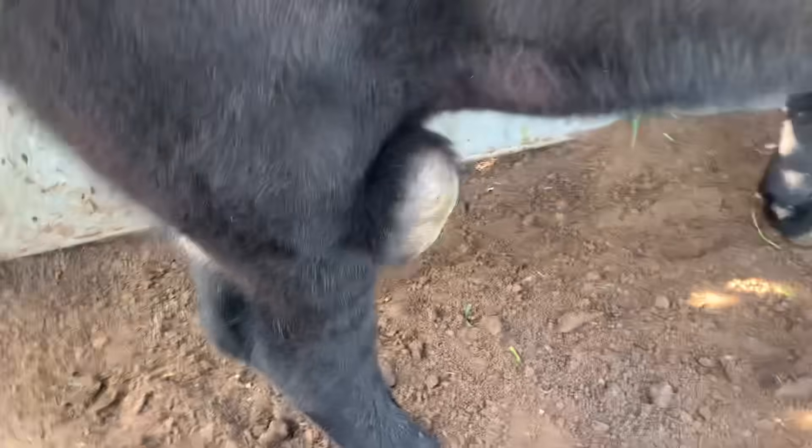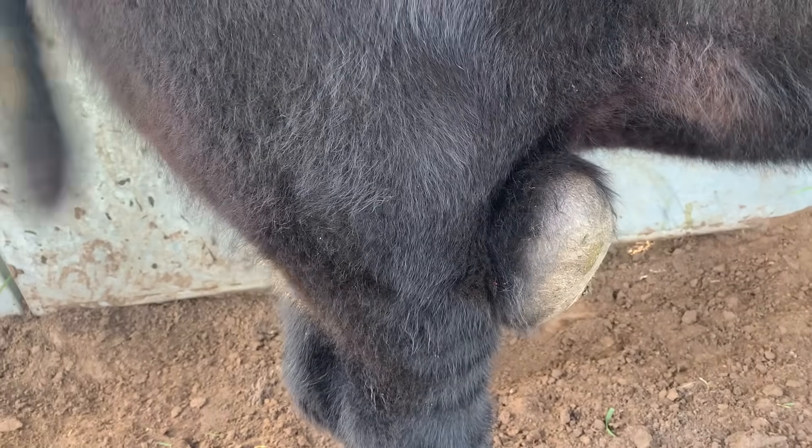Massive. There's a mass for you. We're going to try to remove this mass. If we had a calicrate bander, we'd band that and it'd probably drop off, but we're going to remove it surgically.